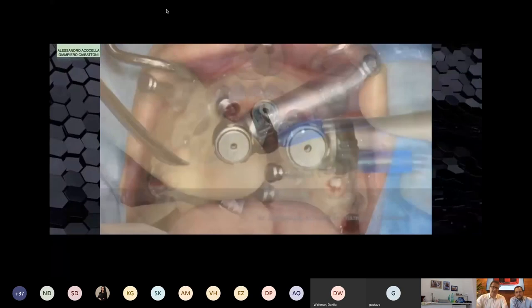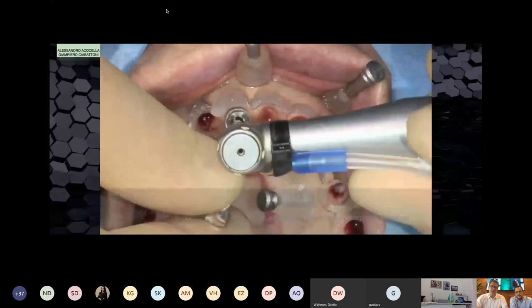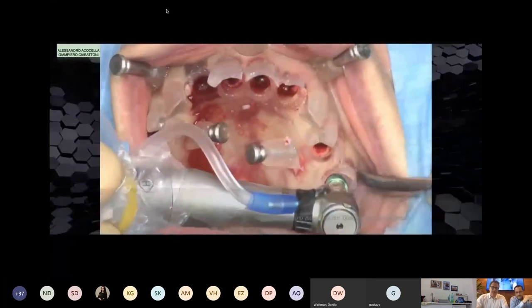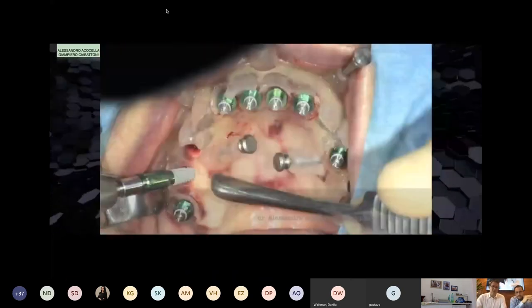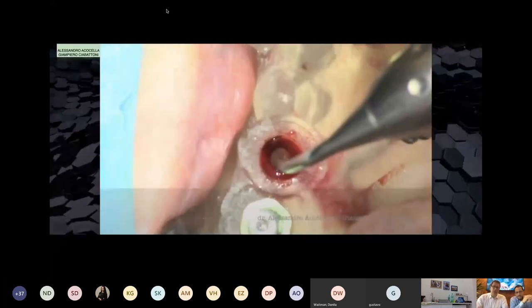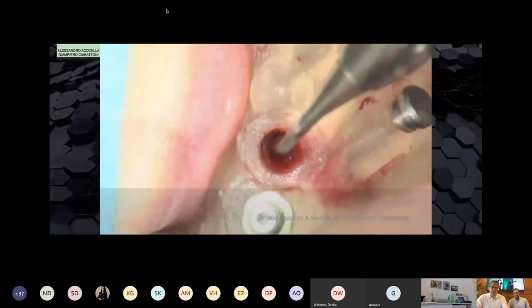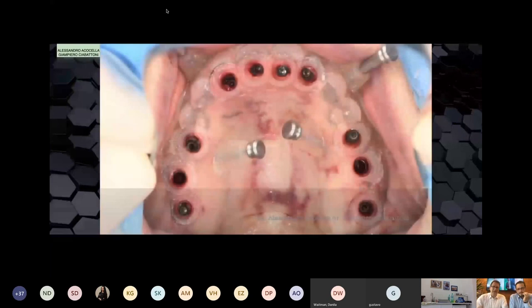And you start with the same surgical index, position, lingual pin, like Alessandro said, and we start to manage the drilling, the implant, and we also plan to do two sinus elevations from the crest of the patient without opening a flap. You see one osteotome, and now we can fracture 1 millimeter of bone, and we try to remove from the guide to elevate the sinus to insert one implant of 4 millimeter of length. Okay, final position.